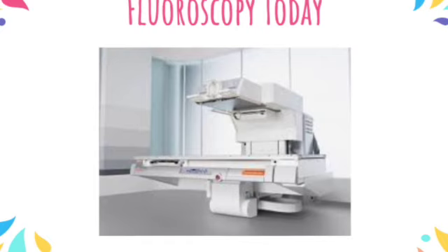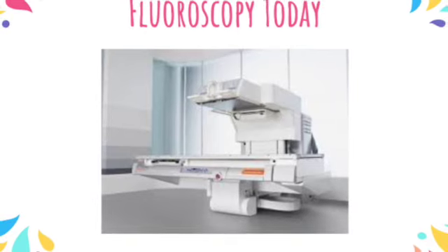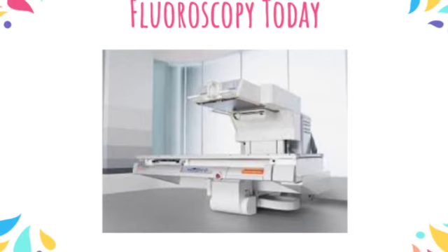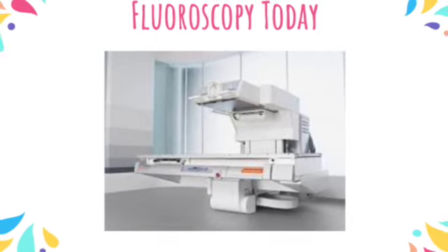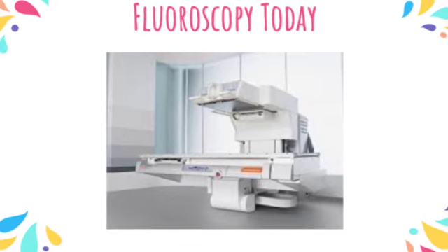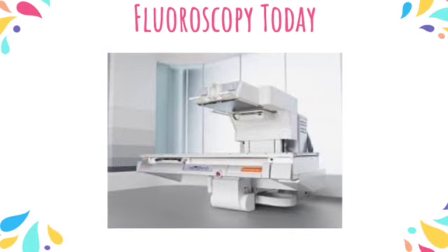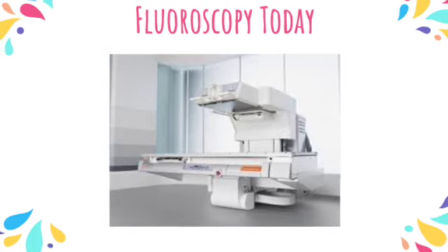Fluoroscopy units are now composed of image-intensified systems and flat panel detector systems, which use different materials and decrease patient exposure. In an image-intensified system, the input phosphor converts X-rays to light. The photocathode absorbs that light and converts it to electrons. The output phosphor converts electrons back to light, but there are more electrons than when we started with, which causes the image to be brighter than previously achievable.